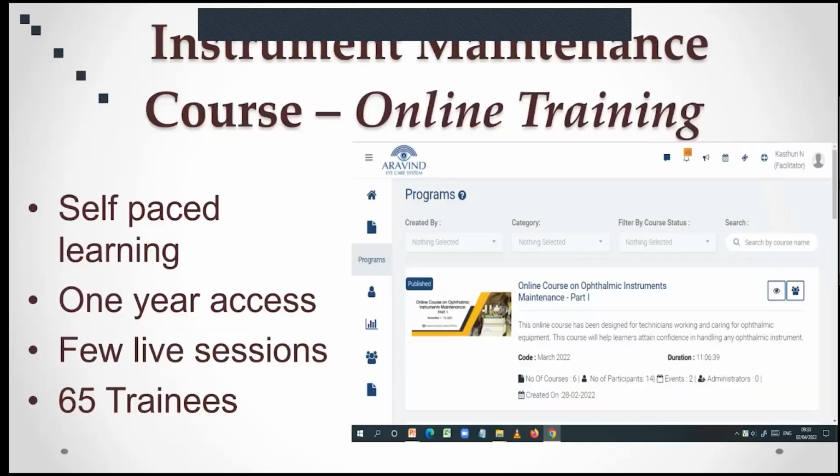And there is also a program available online. We have such wonderful videos, which I played earlier. That is one of our online training videos. It's a self-paced learning program. We give you 1 year of access, so you can go through this program for 1 year. We also have a few live sessions to interact with the facilitators. And we have trained 65 trainees using this online platform.